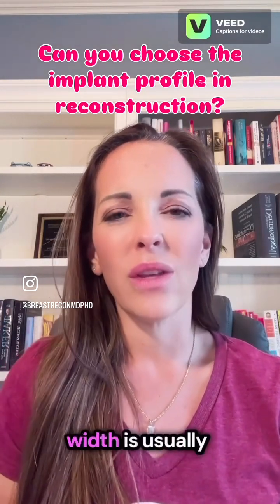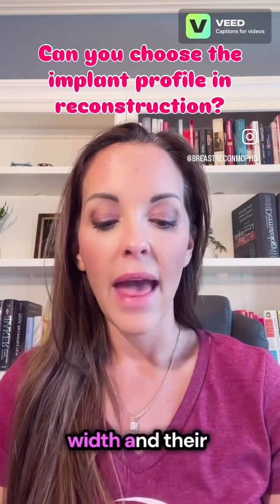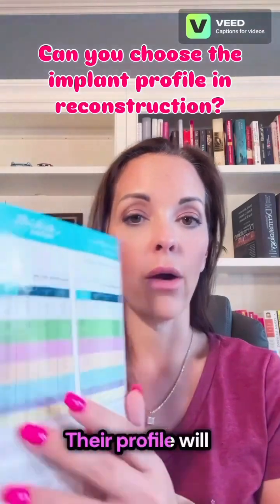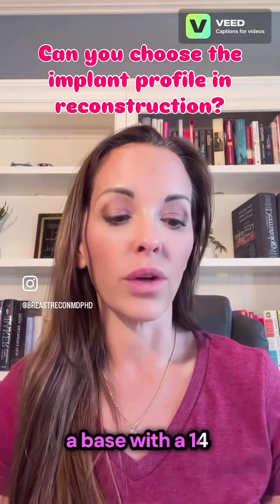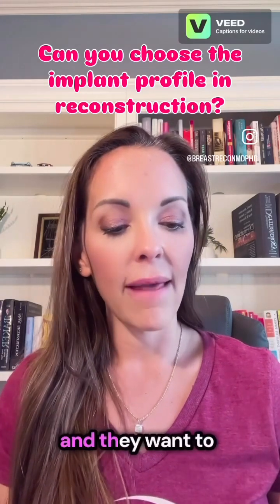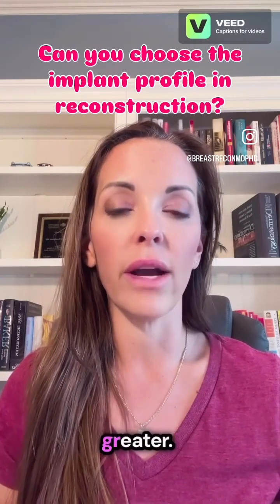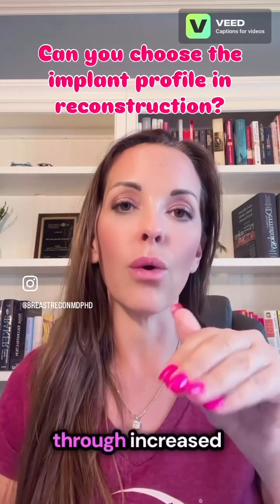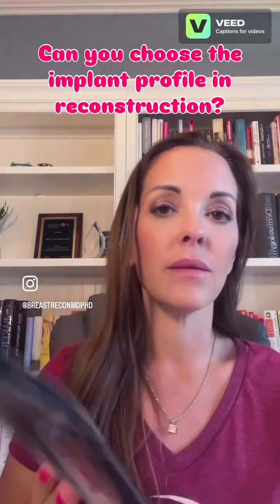So an average base width is usually somewhere around 14 centimeters. So let's say a person has a 14 centimeter base width and their implant size is 520 cc's. Their profile will be a moderate profile. Now let's say that same person that had a base width of 14 wants to have a ginormous implant. So they really expand the skin with the tissue expander and they want to have a 650 cc implant. So like 200 cc's greater. Since the base width is fixed, the only way to get more volume is through increased projection. So that person would have an extra full implant.